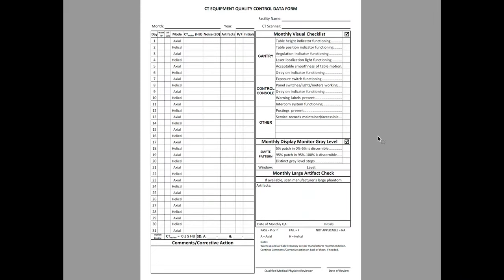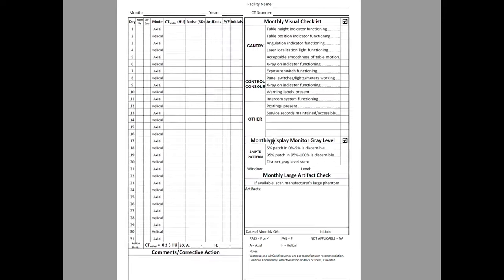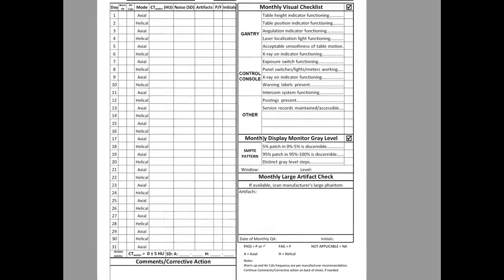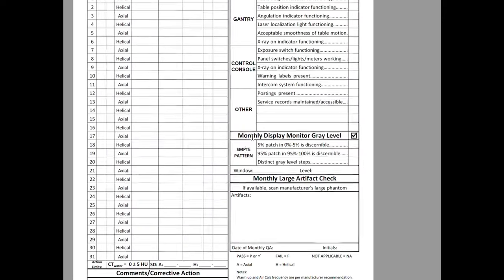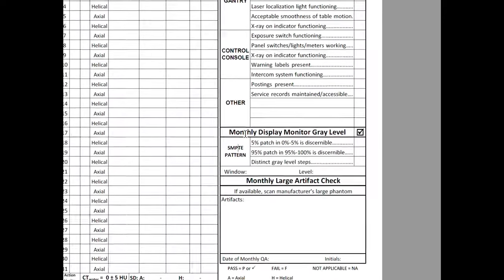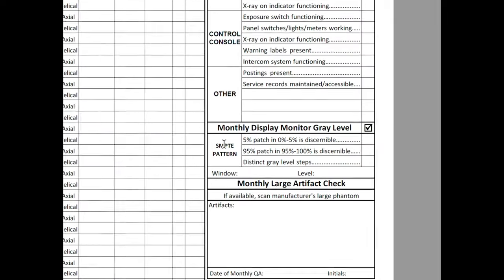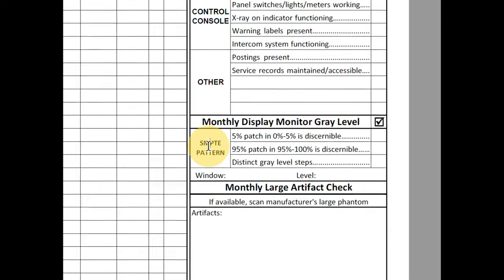Okay, so this document is the CT equipment quality control data form that is provided to us from the ACR. And what you'll notice, you have all of your daily QC that you're going to be documenting on the left-hand side. You have your monthly visual checklist. But then you have this monthly display monitor gray level. And right here, it shows you SMPTE pattern.